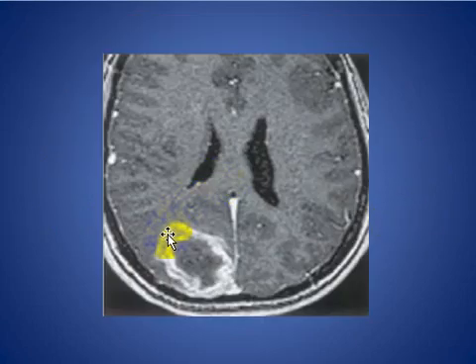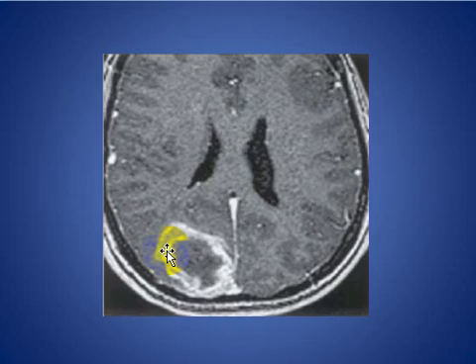Here we see a mass lesion on T1-weighted MRI, biopsy-proven to be a tumefactive demyelinating lesion secondary to multiple sclerosis.